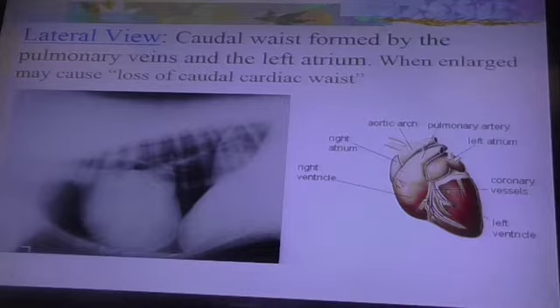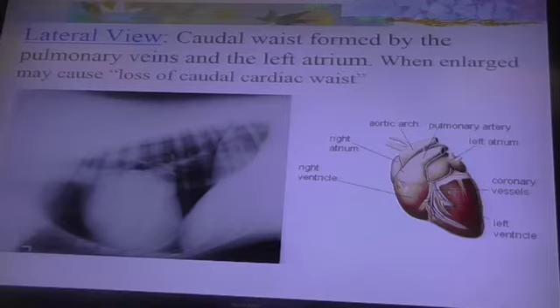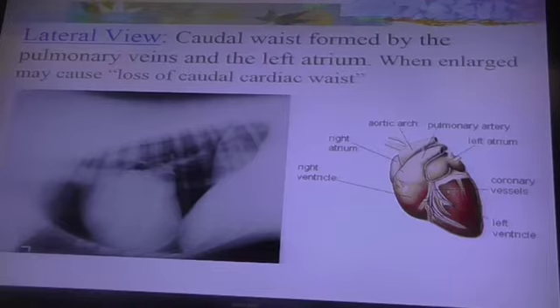So if you look there, the vein is enlarged. Great. Then wouldn't that fit? Yes. But it doesn't have to be enlarged. And then from that point, you look at the dorsal ventral. Now, you have two vessels, one lateral and one medial. Am I going to look at the one lateral, or am I going to look at the one medial? Lateral. I'm going to look at the one lateral. I'm looking at the one medial. Which one now? Because if you look at the wrong one, I'm going to give you a wrong diagnosis. Am I looking at the one lateral or the one medial?